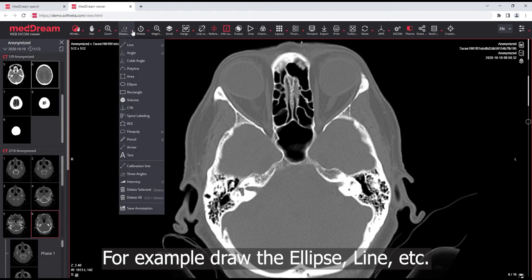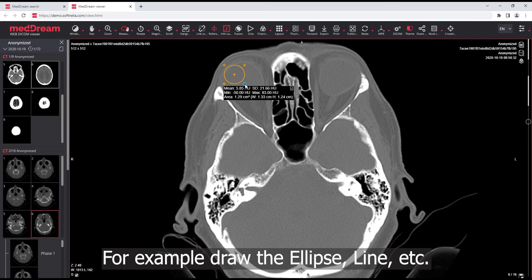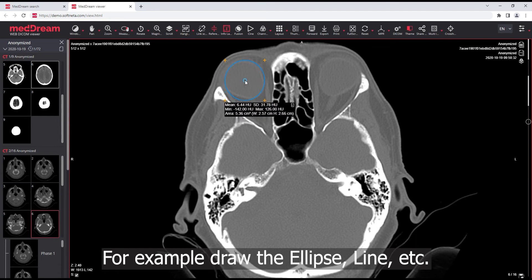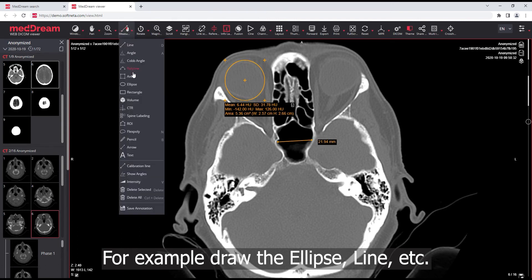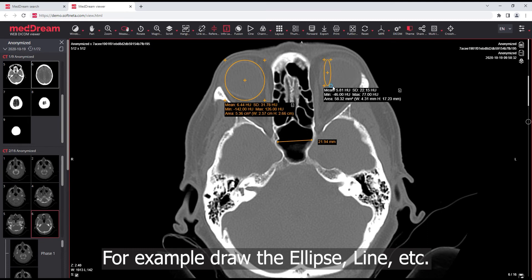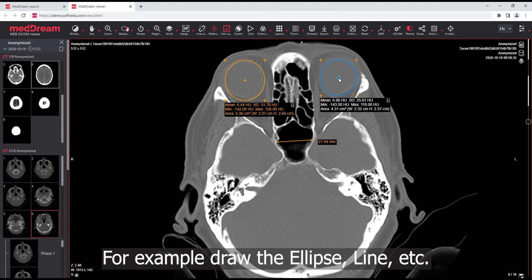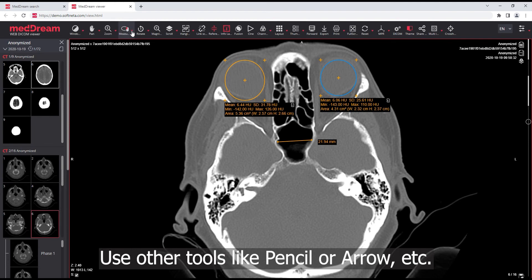For example, draw an ellipse, line, or other measurements. Use other tools like pencil or arrow, etc.